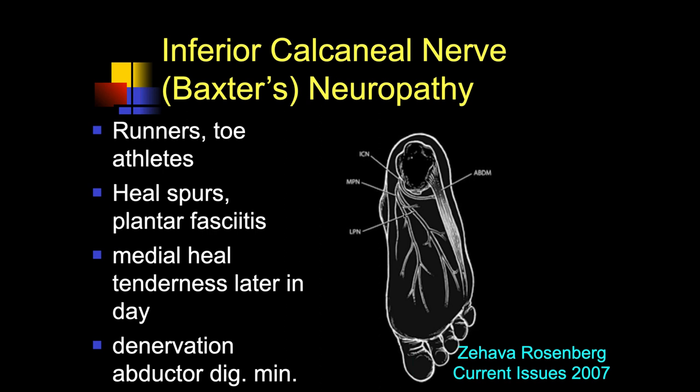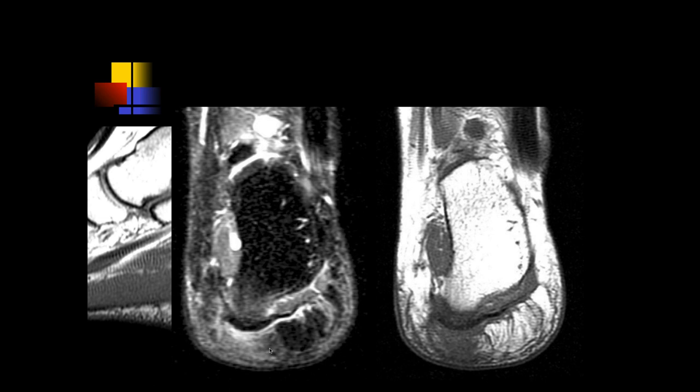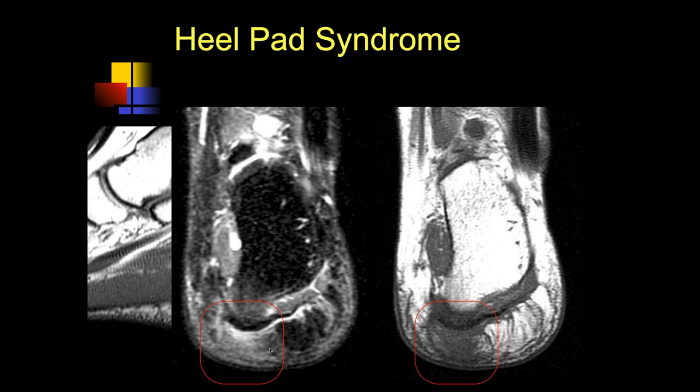You get medial heel tenderness, typically late in the day, and then denervation atrophy of the abductor. Another patient — all these patients have heel pain. We can see the skin marker along the heel and some soft tissue edema within the subcutaneous fat. The central cord is mostly showing superficial edema in the adipose — it's a pressure type of lesion.